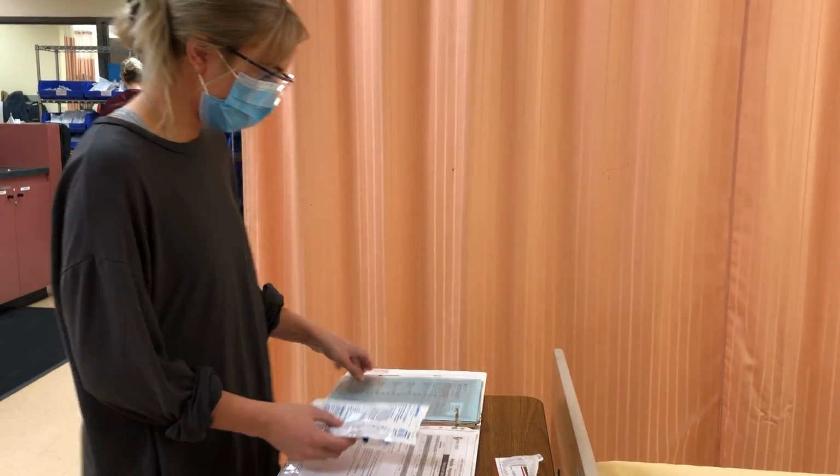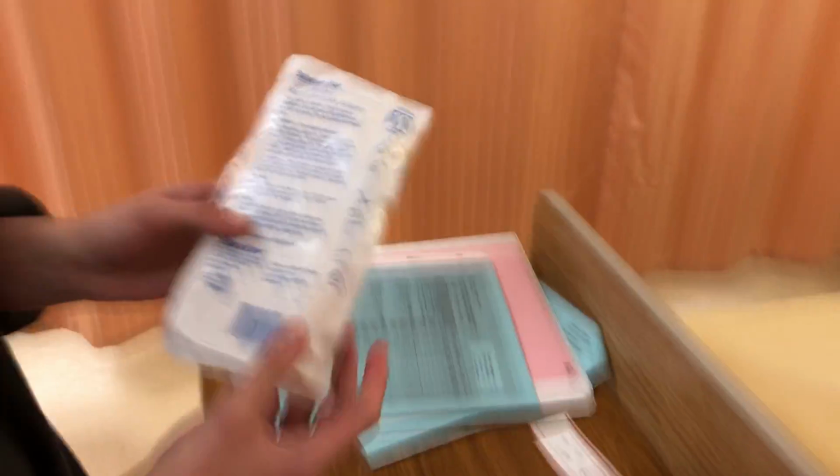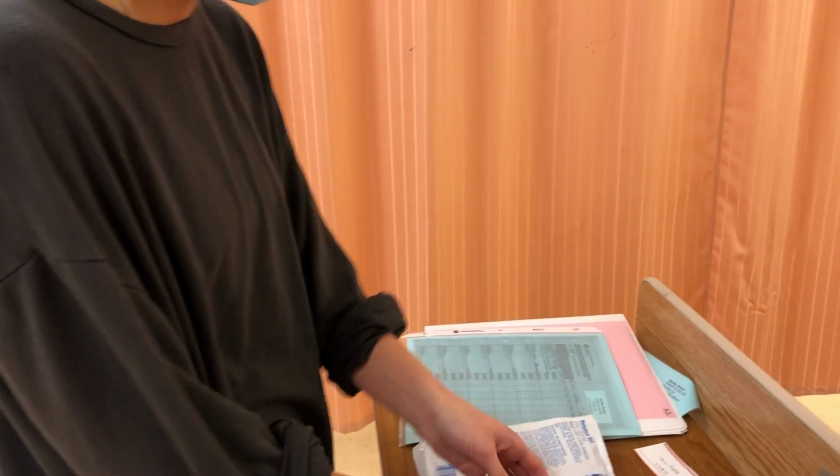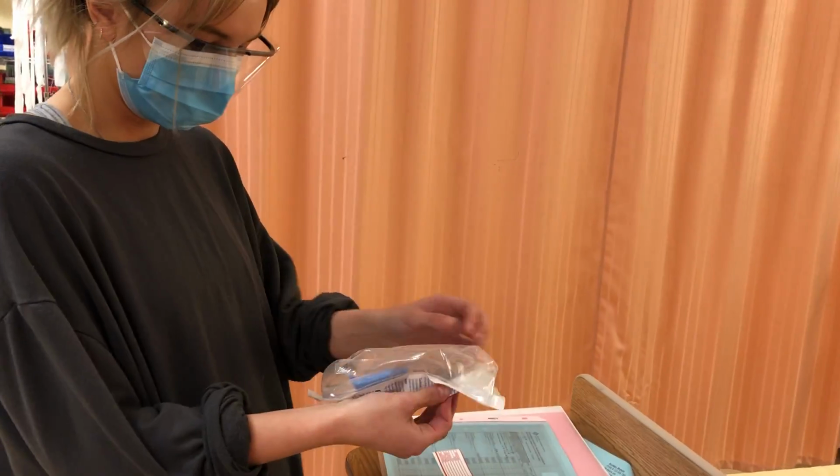So going into the patient's room, I will have the MAR and portless tubing and my medication bag. And I'm just going to label my tubing before I go in.